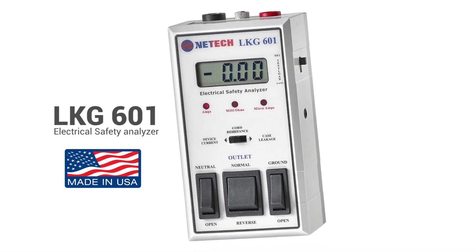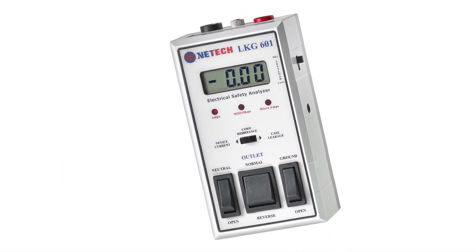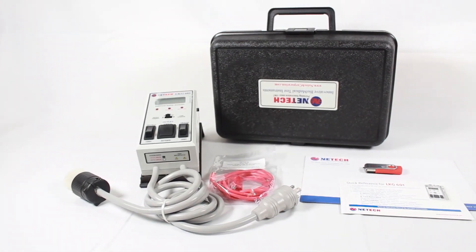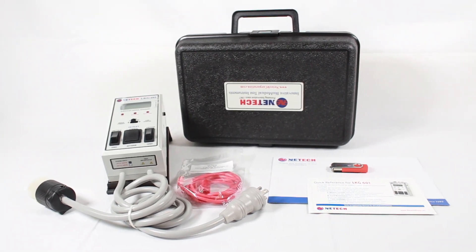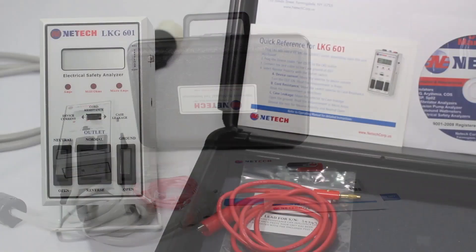The LKG601 is the most popular electrical safety analyzer for testing non-ECG equipment. With its user-friendly operations, the LKG601 is compact, lightweight, and available at a better price than any competitor's products.